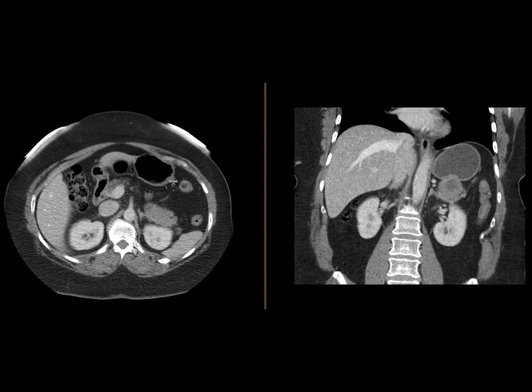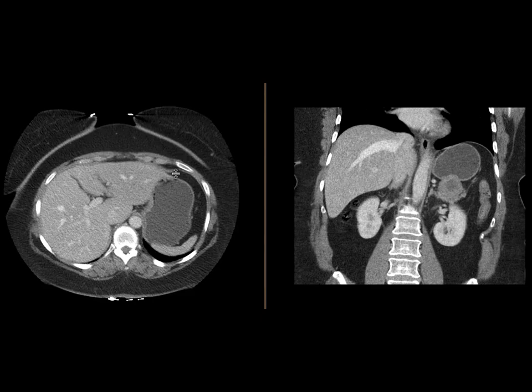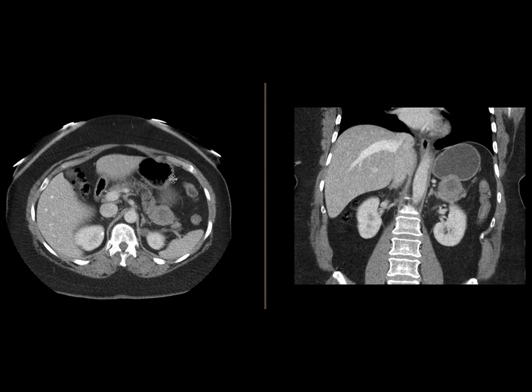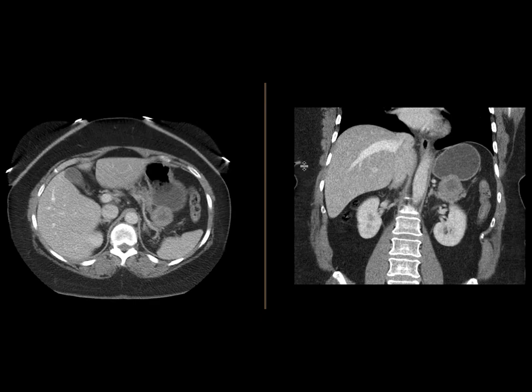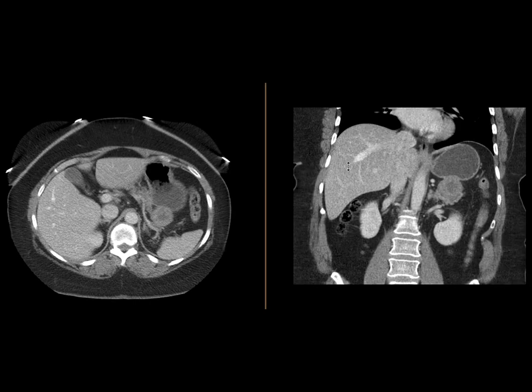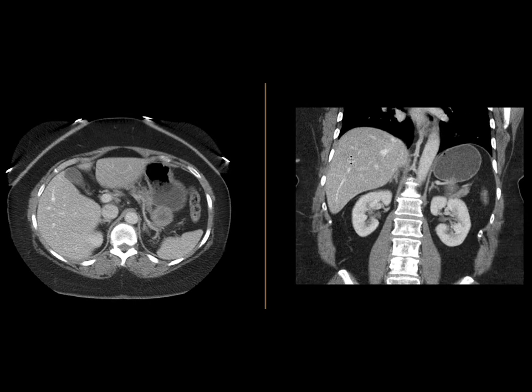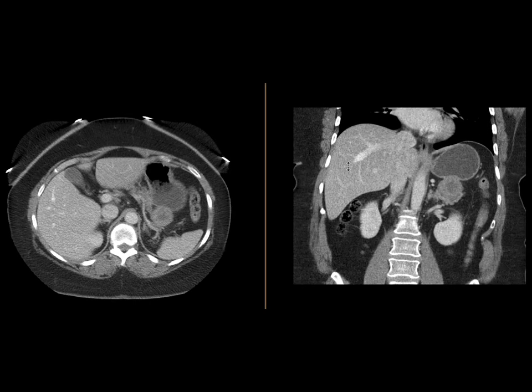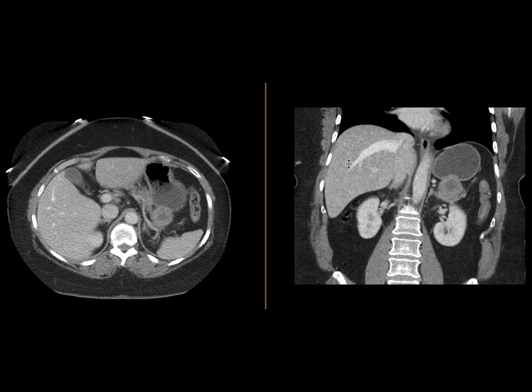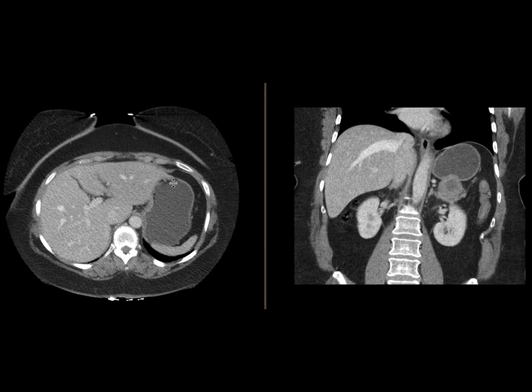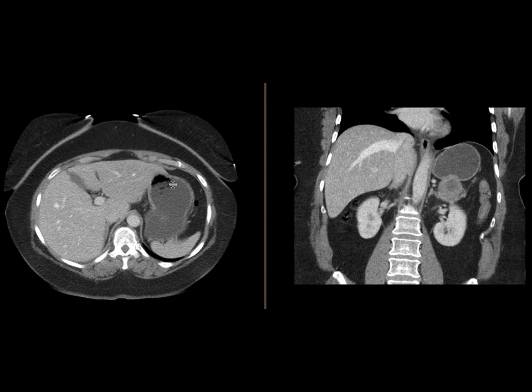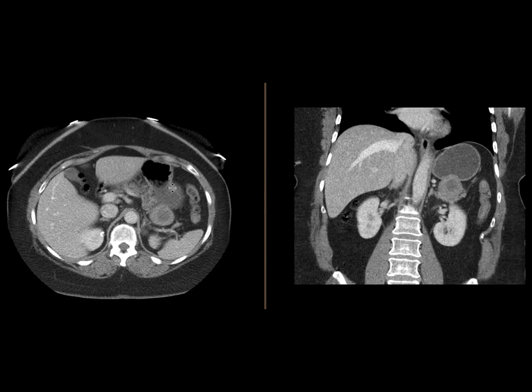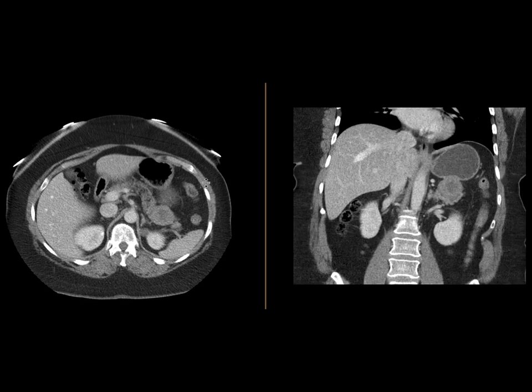The last possibility is a gastrointestinal stromal tumor, or GIST tumor. These can arise from the stomach — they typically arise from the submucosal layer and grow exophytically. They can have a heterogeneous appearance like this, and they are essentially never associated with adenopathy.